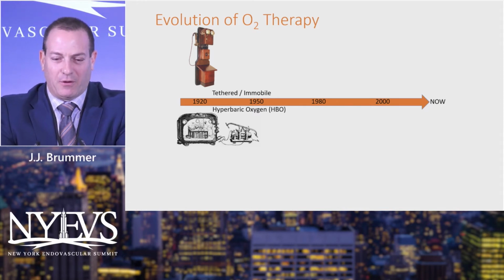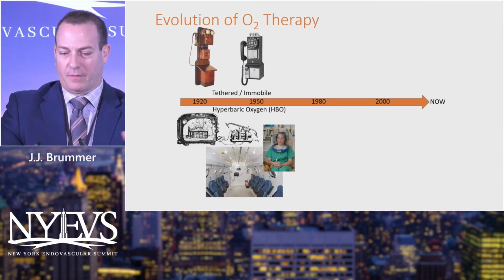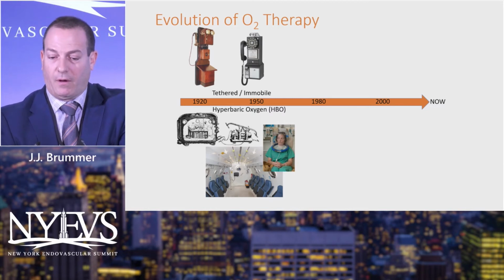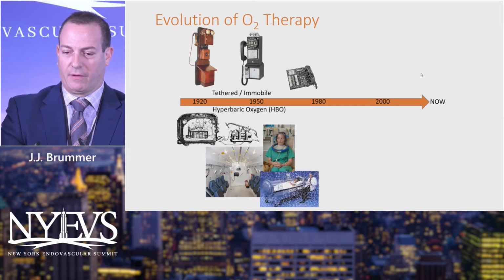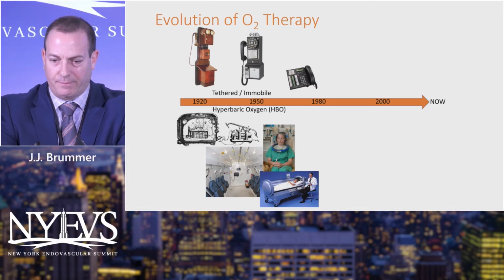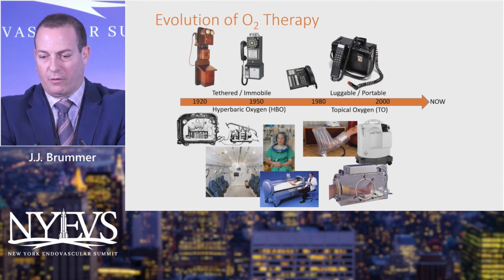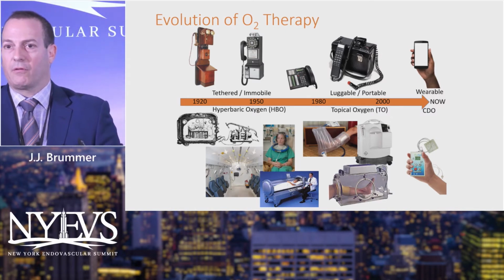So you'll see how we started with these large chambers, a big, immobile type of encasement. And you can see over here where there's a patient that's placed over their head, and then below that is that big hyperbaric chamber, which is used for divers and astronauts, and to show you the different things. And as it evolved, here we come with our phones. Here are our individual chambers in the 80s. And then we have some portable units, such as that familiar picture on the bottom, which I was showing is another way of continuous diffusing oxygen. And now we're in the cell phone age where everything's wearable, right?